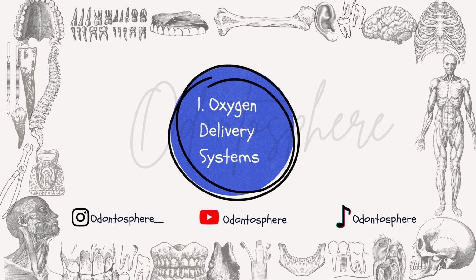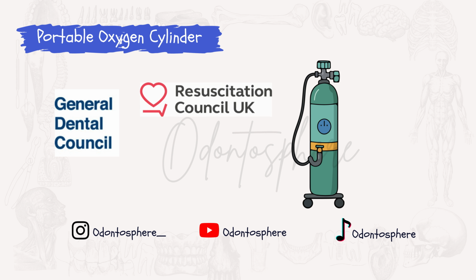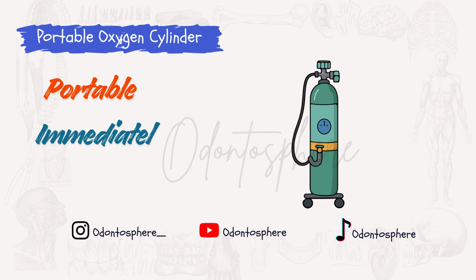Some of the essential pieces of equipment that allow us to deliver oxygen effectively during a medical emergency in a dental setting include a portable oxygen cylinder. Now, we know that the GDC states that all dentists or registrants must follow the guidance set by the Resuscitation Council UK. So, when it comes to this piece of equipment specifically, the requirement is that it must be portable and immediately accessible in clinical areas.